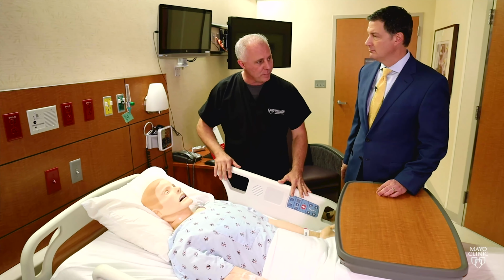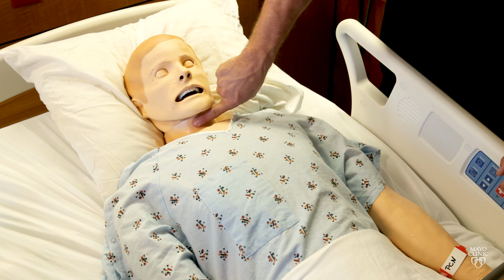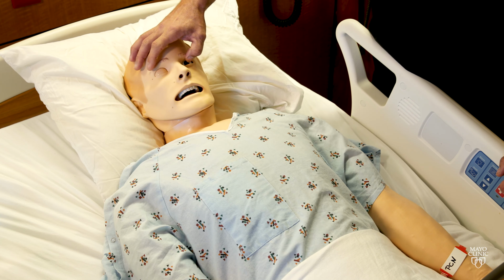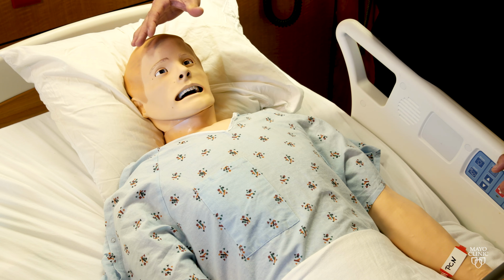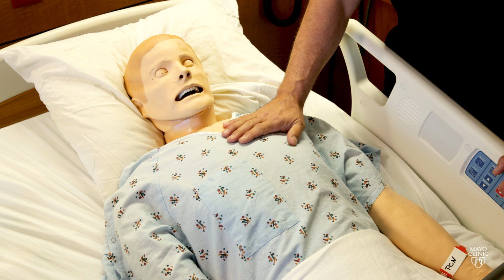Yeah, and this is almost a real patient, right? Yeah, so this is a Sim Man. He's one of our medical mannequins, and he allows us to do multiple types of scenarios. So you could do chest compressions on Sim Man, you could do an emergent airway on him, you can actually do an intubation on him. His eyes, if you open his eyes and actually shine light, his pupils react just like our pupils react. He can cry, bleed, sweat, he can even urinate. So we can train every aspect of the medical situation.